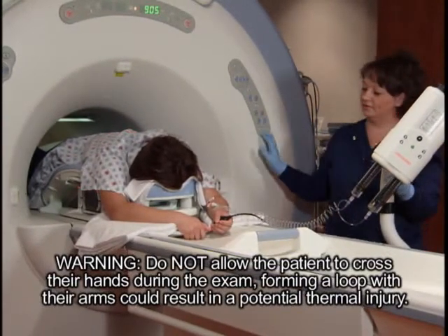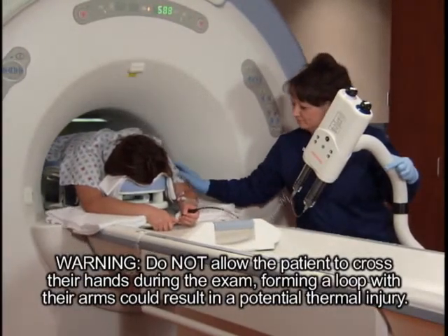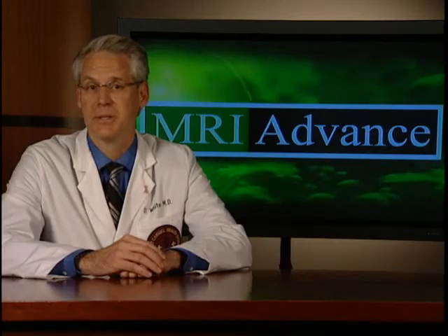of this inspection, or if complaints by the patient indicate that there may have been a partial infiltration of the bolus, the site of the bolus is imaged to assess for extravasated contrast. This must be noted for the interpreting radiologists so they can bear in mind the possibility that the curves may be diminished due to an incomplete bolus.